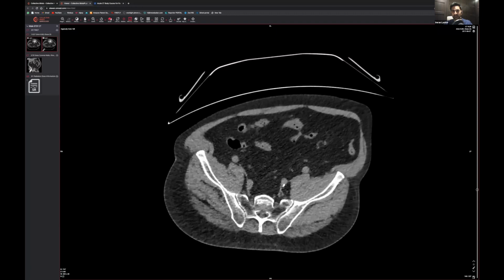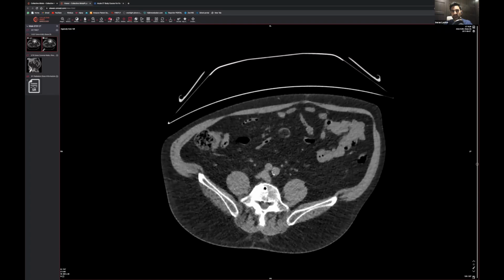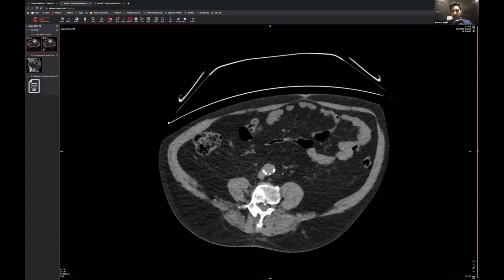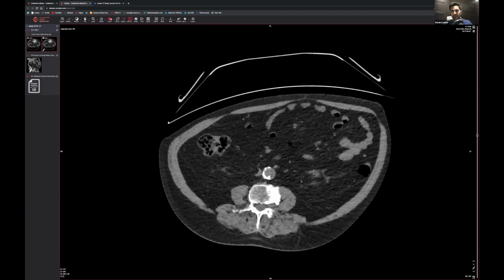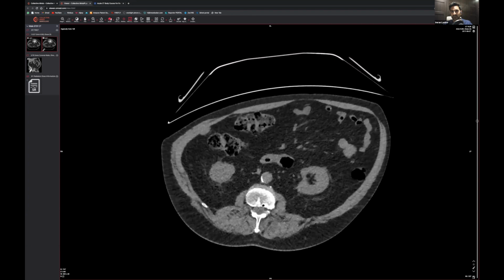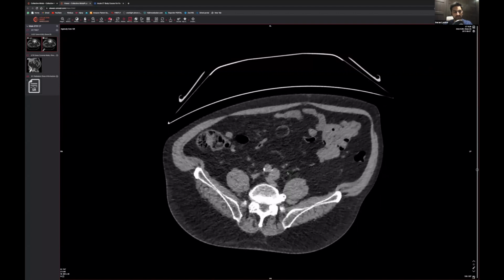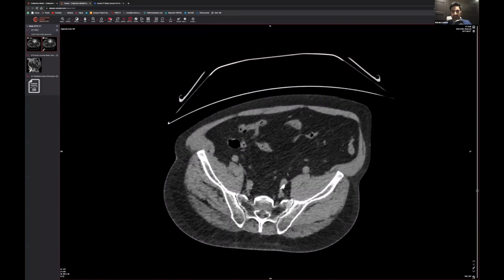That's ureter there, ureter there. Just keep coming, ureter there, ureter there, I think. Probably keep coming up. And I think probably it's veered off. So I haven't followed the proximal ureter as well as I could have. So I'm going to try that again. You can see ureter, ureter, ureter, down this way. There we go. Now that makes more sense. And there's no stone whatsoever in this patient who's got this pain.